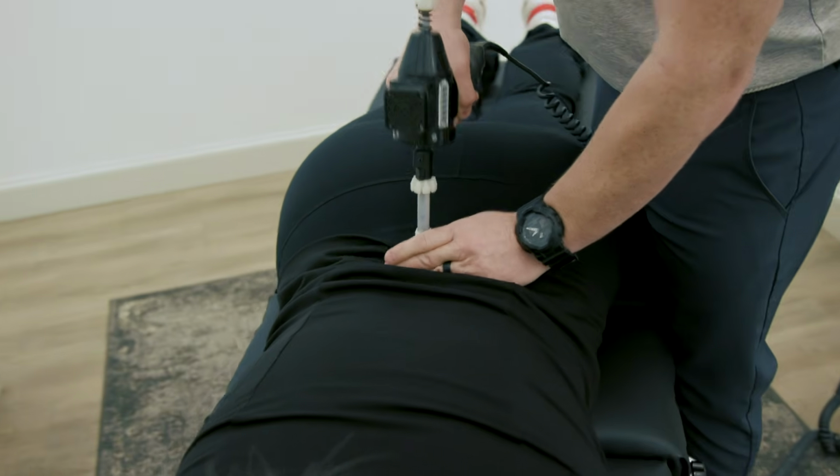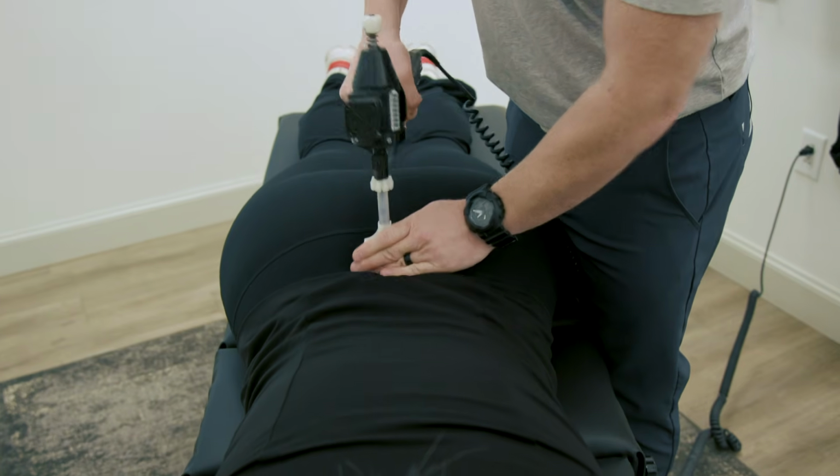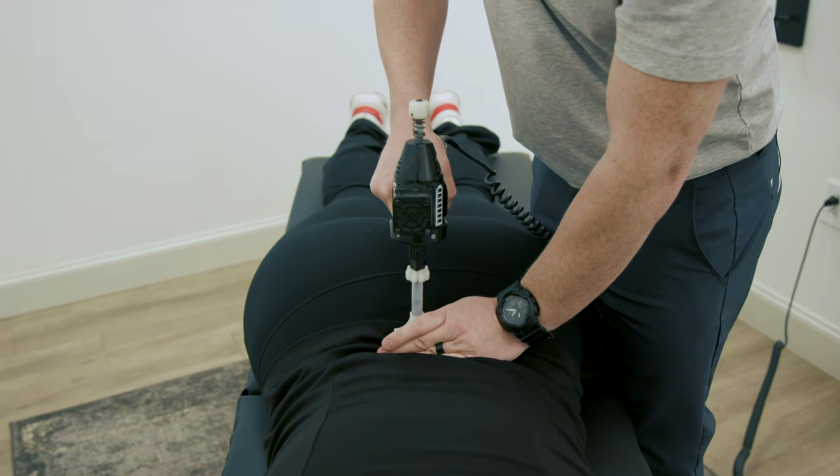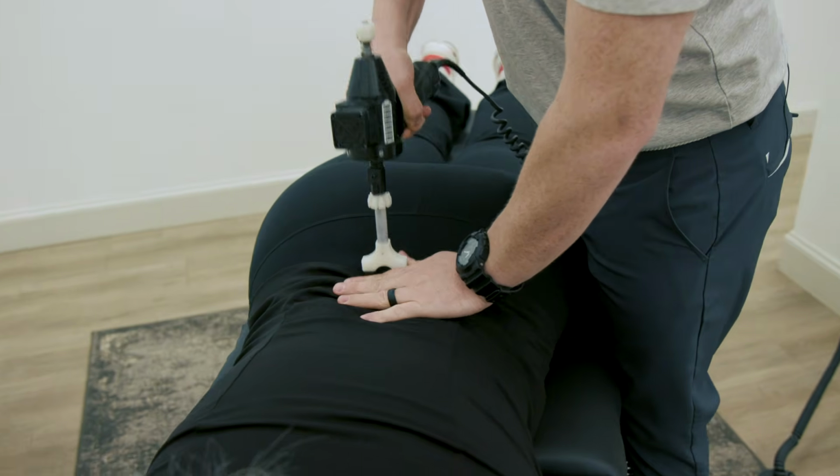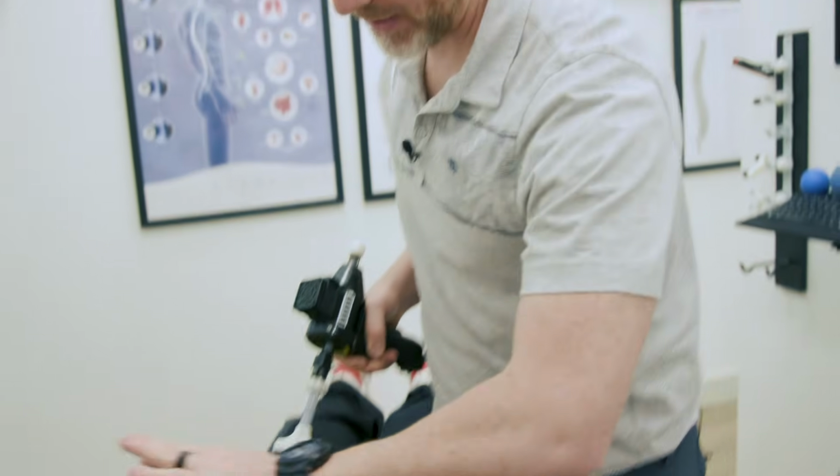And patients really enjoy this adjustment, especially if they don't like the manual adjustments or the popping or cracking. But that is how we're going to start to correct that curve to make her spine stronger and more stable.